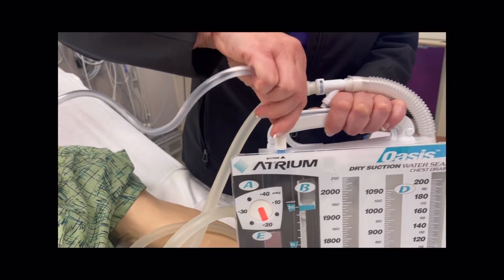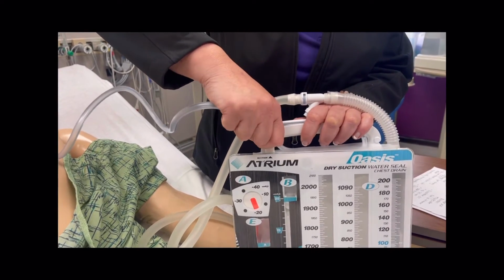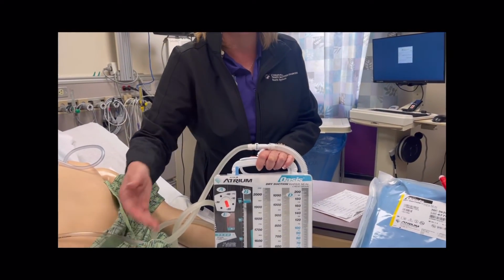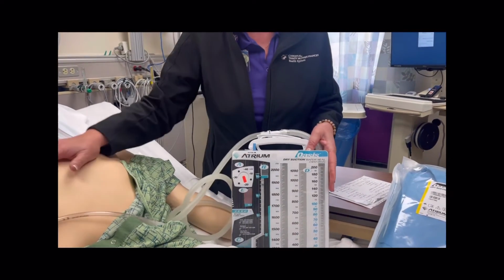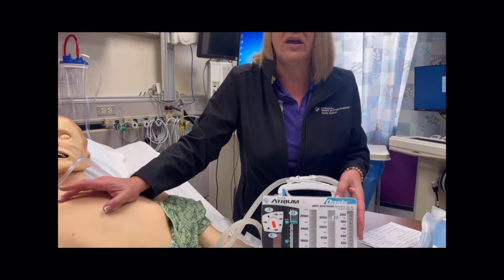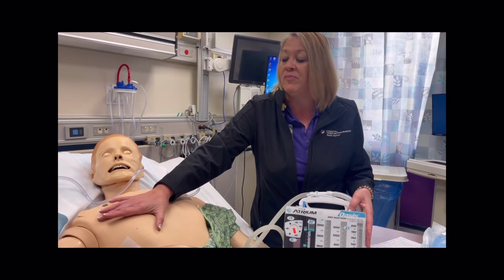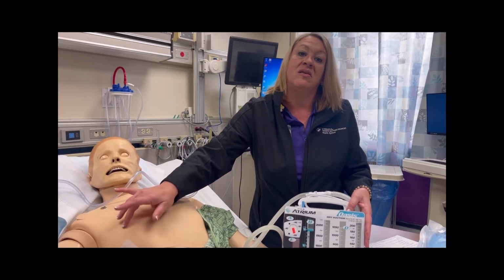So when this is on, we're to suction. When the provider wants to wean to water seal, this is removed. That's the only thing that has to happen. Of course, this is going to be on the floor. As the provider is weaning, of course, we want to be assessing our patient and make sure they're tolerating it and they're not becoming tachypneic or tachycardic or restless, short of breath, any of those signs that they may have some kind of increasing dyspnea or work of breathing, which could be, again, a pneumothorax, which we've already discussed.